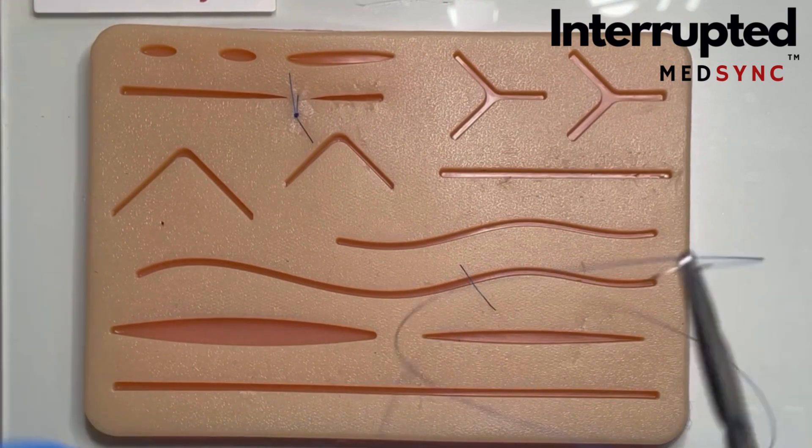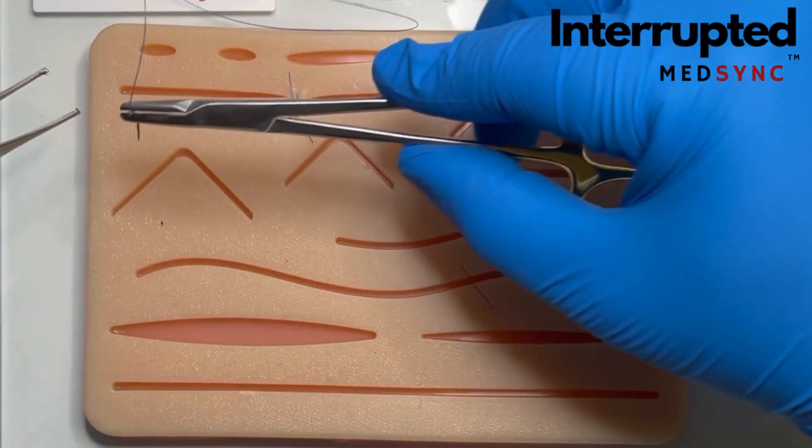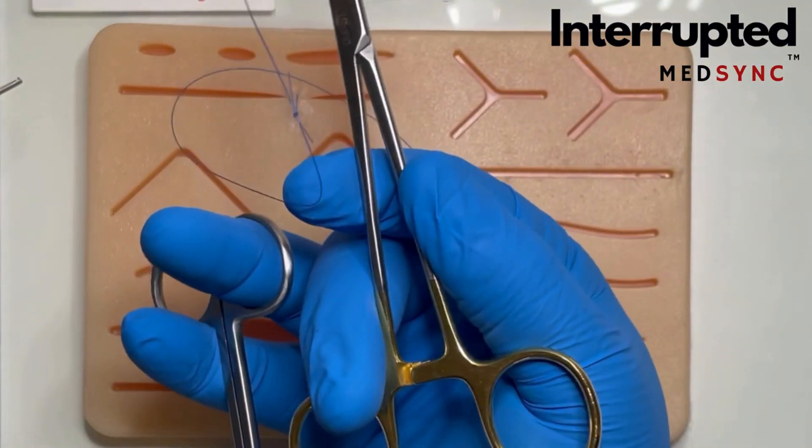The Interrupted Stitch. The most essential technique for closing wounds. Enter at 90 degrees.